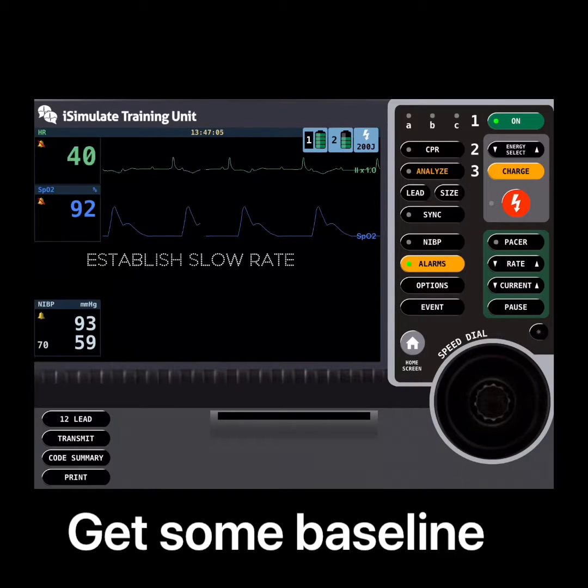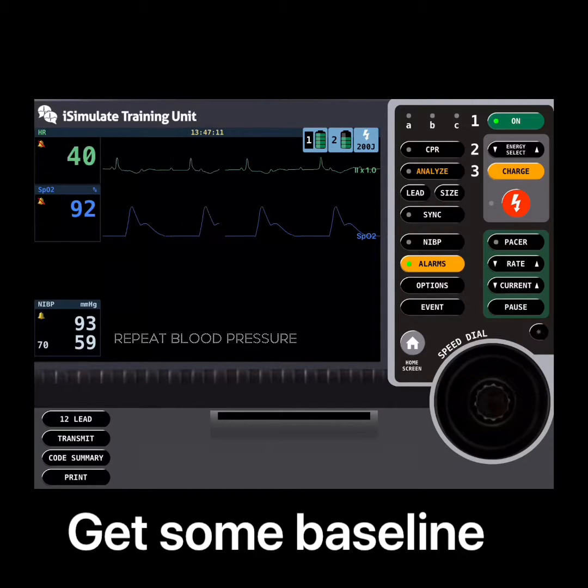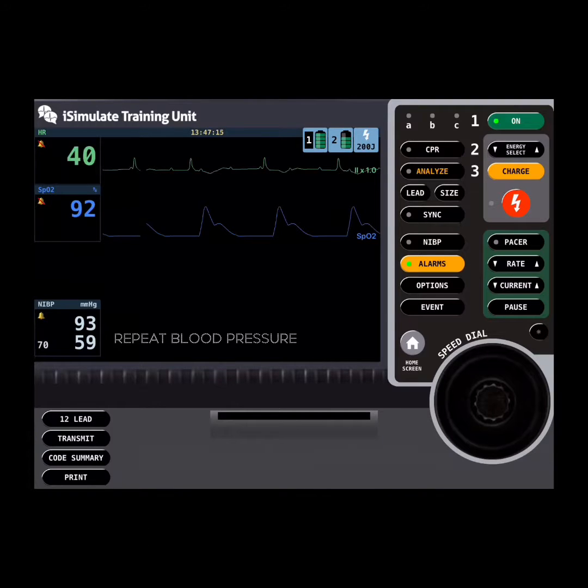In this case we had a 54-year-old male, heart rate of 40, sats of 92, blood pressure 93 over 59. The team that I was working with repeated the blood pressure just to establish that that was right.